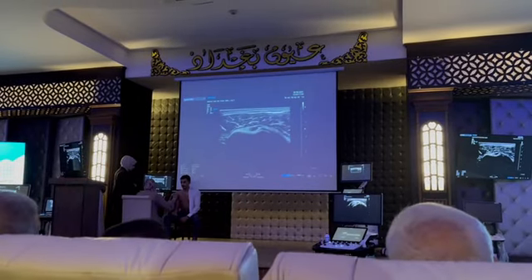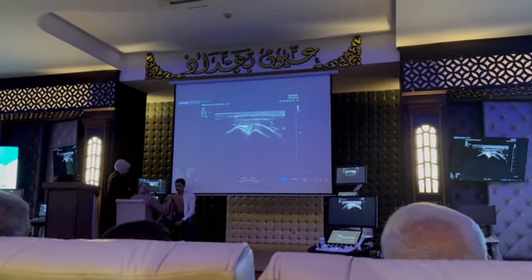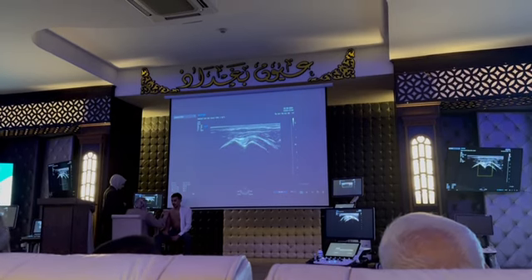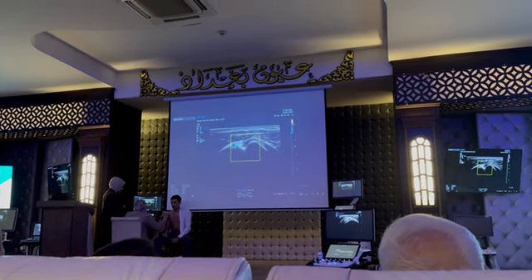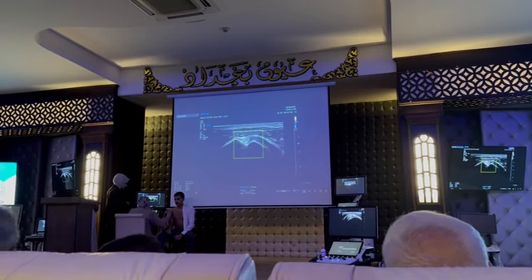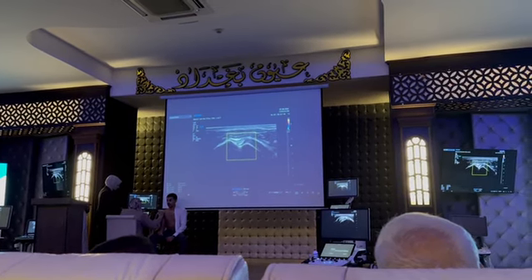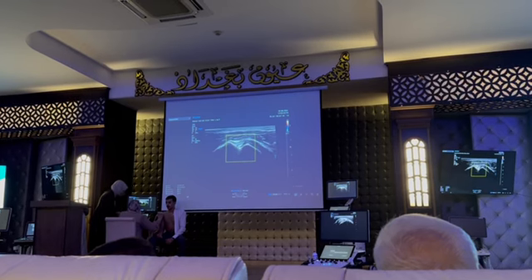Upward, upward until I reach what? I reach the bicipital tendon. Now if I open the color Doppler, it should be just behind the biceps tendon, the long head, easy with the scale.